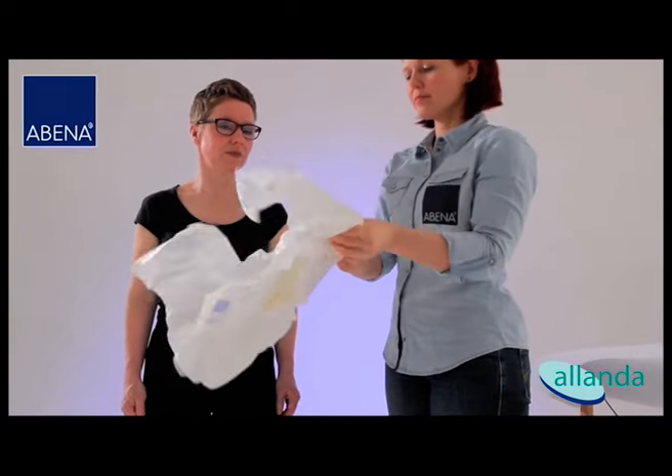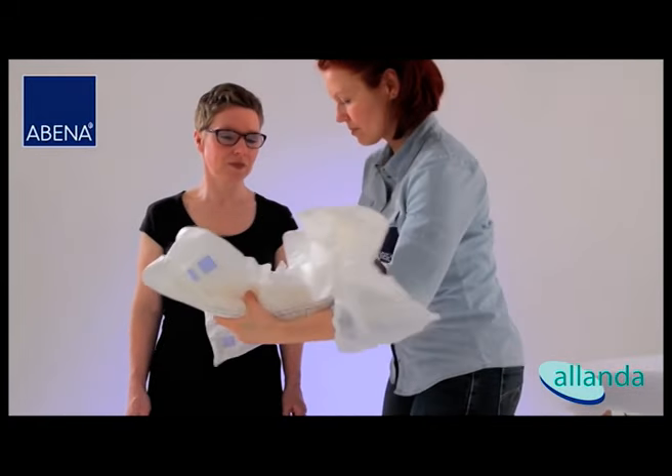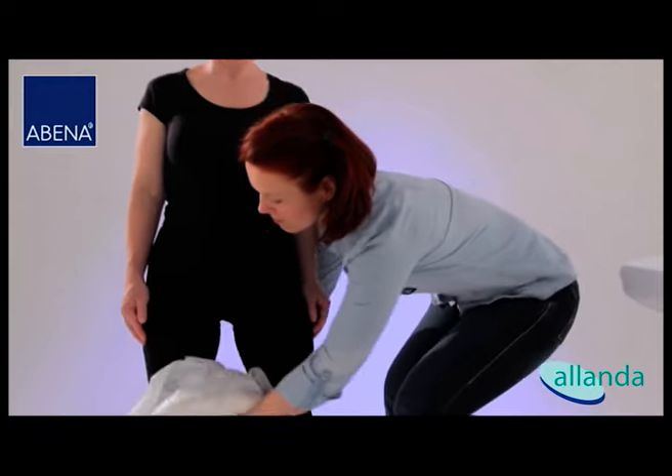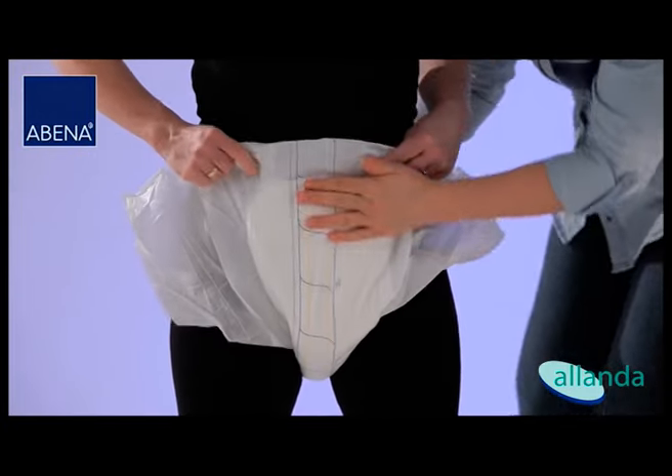Take the brief and hold it in the middle to secure the bowl form of the product. Ensure that the tapes are at the rear side. Pass the product between the legs from the front to the back and make sure that the product fits properly in the groin area.